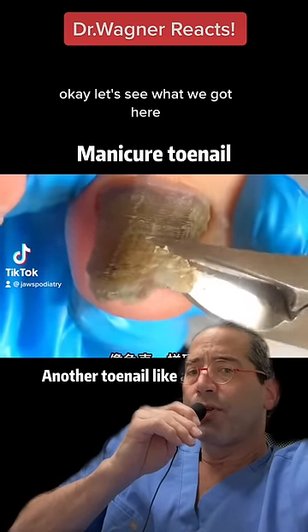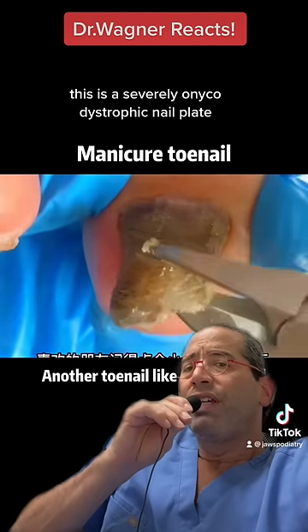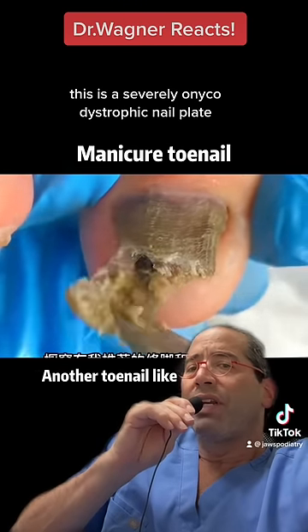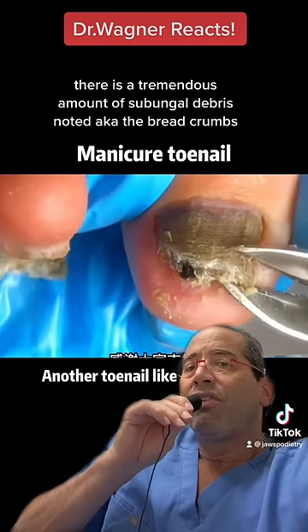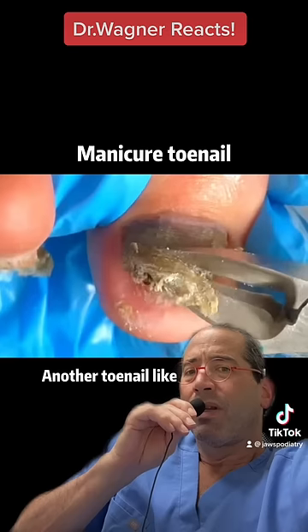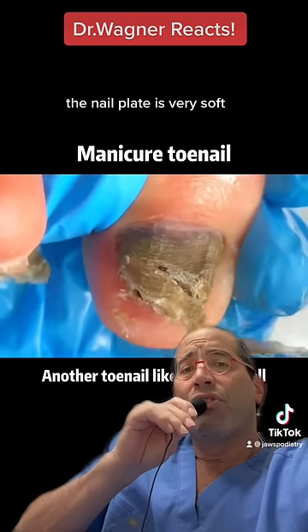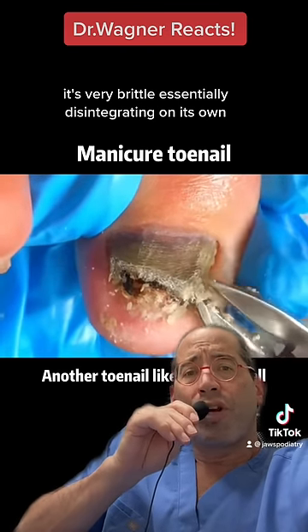This is a severely onchodystrophic nail plate. There's a tremendous amount of subungual debris noted — the breadcrumbs. The nail plate is very soft, very brittle, essentially disintegrating on its own.